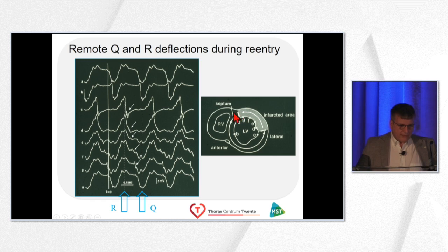And you could see that here it exited from the scar at the septal site, then went around the left ventricular cavity and entered here the myocardial scar at the lateral side of this infarction. And you can see that very nicely in the signal.